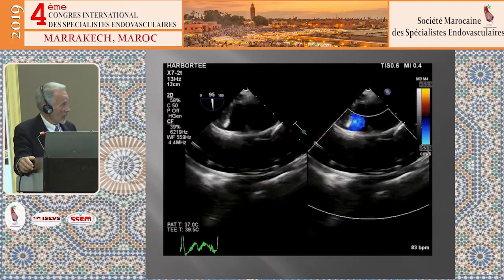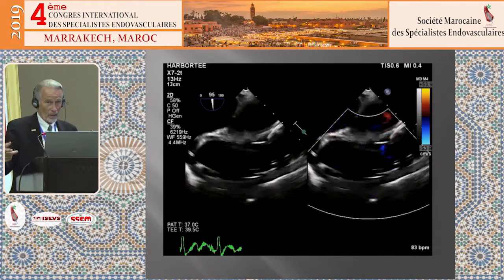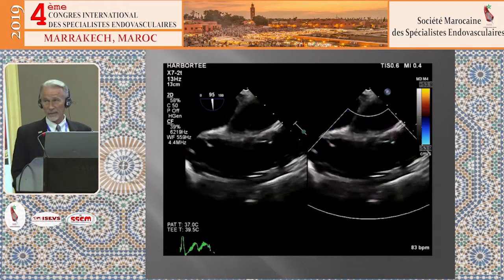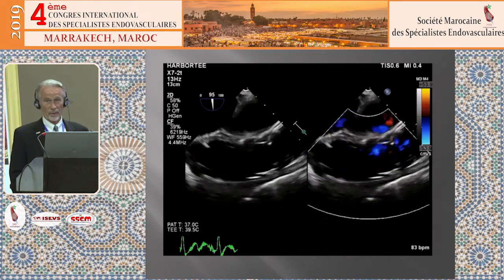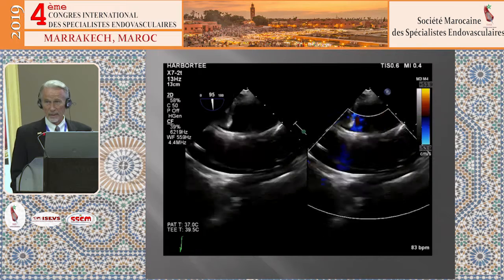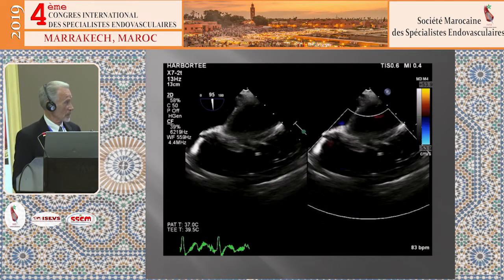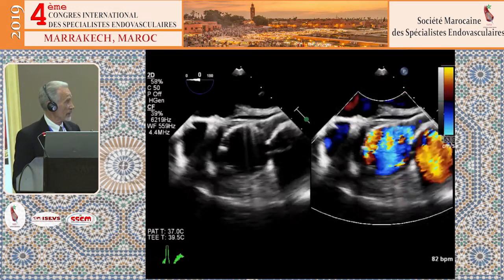aorta, how it's expanded. And this patient, and all of them, we've done 3 of these very quickly. Their hemodynamics straighten out. They were all set to be put on a pump, and we break it down, and then it really ends the case very quickly with everybody being pleased about the results.